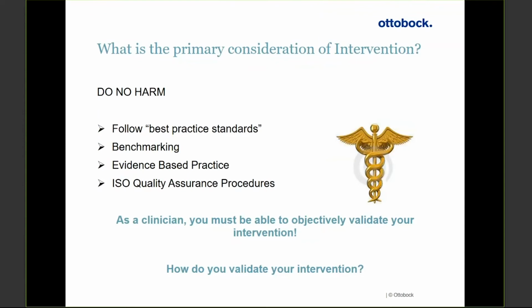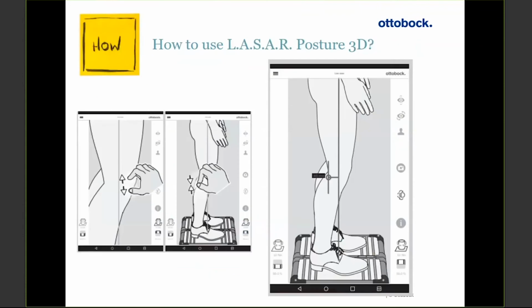So how do we use the L.A.S.A.R Posture? Hopefully some of you have watched my short little 10-minute preview video. I promise you I will record it in a more professional manner when we get back to the office. So I just wanted to point out a couple of things here on the screen. This is an animation of what the tablet looks like.